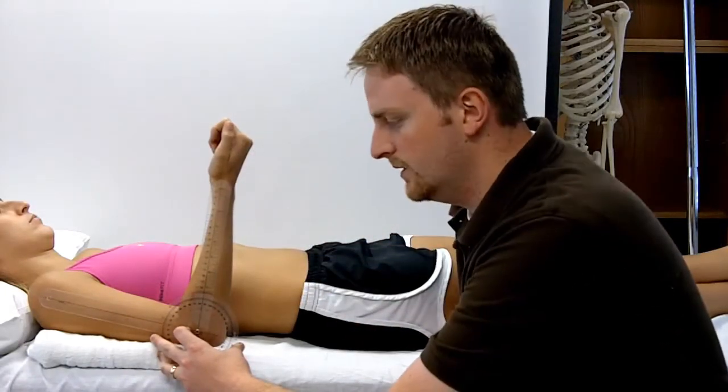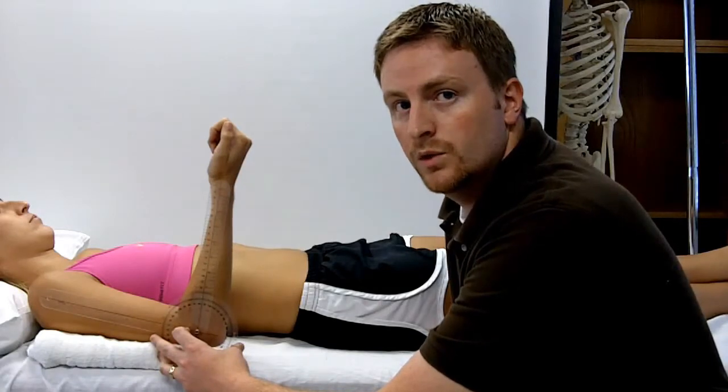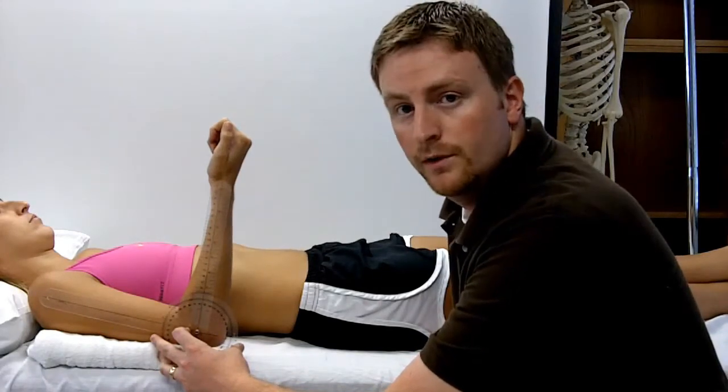In this case, we're demonstrating 85 degrees of elbow flexion, where normal range is 0 to 150 degrees.